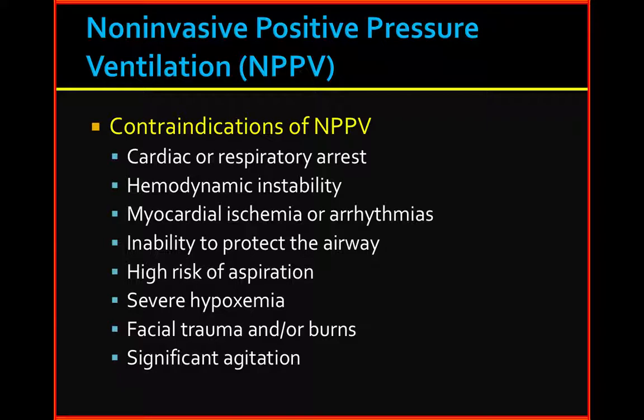Okay? And so there's an actual dial on here where you can actually turn the knob to a specific volume, where you can enter it in. And that volume can be anywhere from 500 cc's all the way up to 600 cc's usually. The ideal way of ventilating somebody would be around 8 milliliters per kilogram ideal body weight. Wink, wink, 8 mLs per kilogram. So anyway, whatever that ideal body weight volume is, it's going to deliver that specific volume in AC mode ventilation.